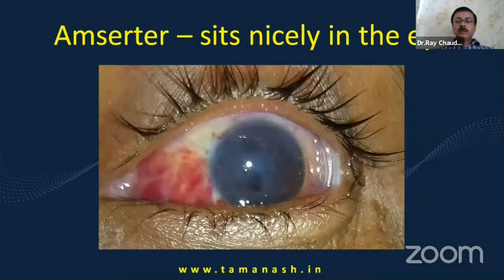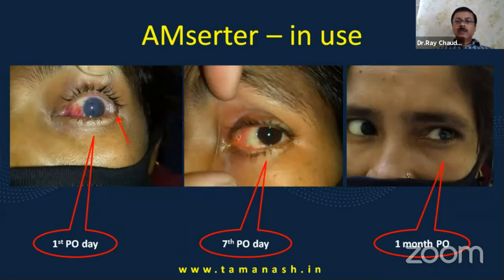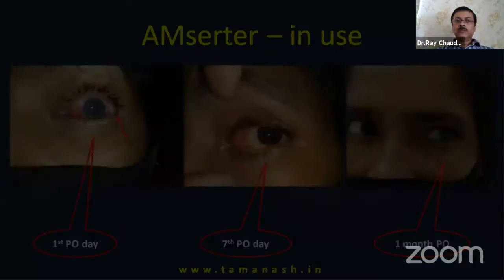You can see that the amniotic membrane, this is the first post-op-day picture. You can see it sits very nicely. There are no problems of lid closure. And you can see how the patient improves, and the patient is completely devoid of diplopia and recurrence now.